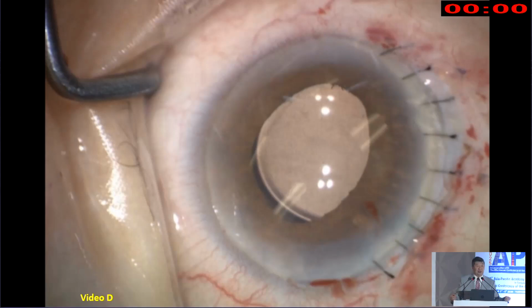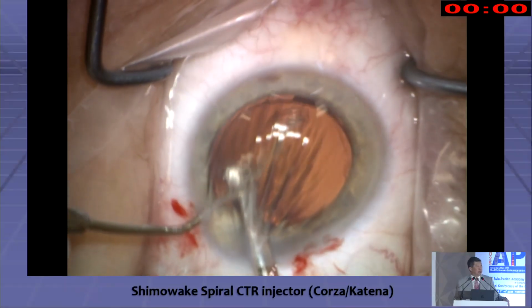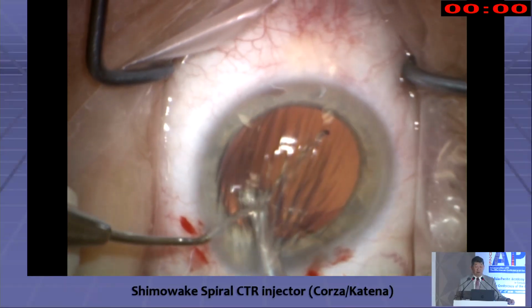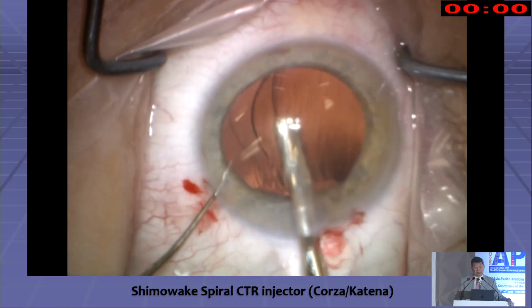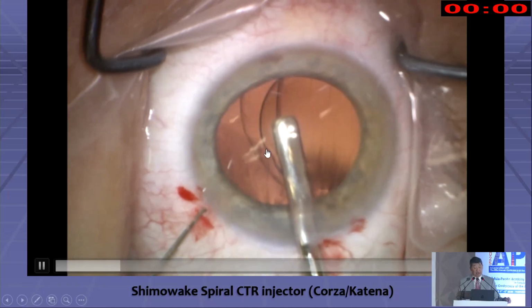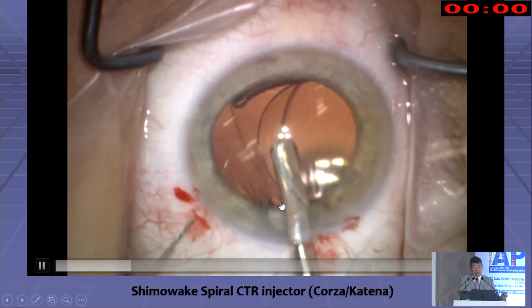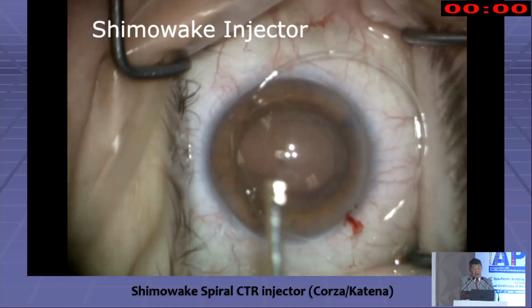Because all the years we did nothing but extra caps, we never had this thing of late bag IOL dislocation. That all happened after the capsular rexis, okay? So if we have one more second, I've showed this a couple times, but look at this. This is actually a dead bag syndrome. Look at this huge zonular dialysis over here. And so this is the problem with the CTR.